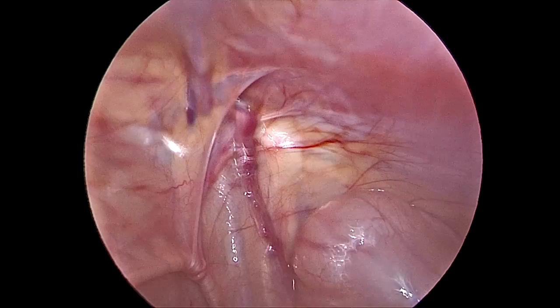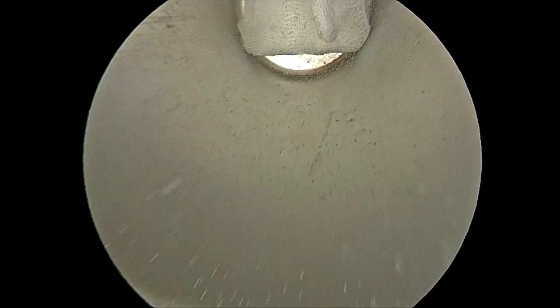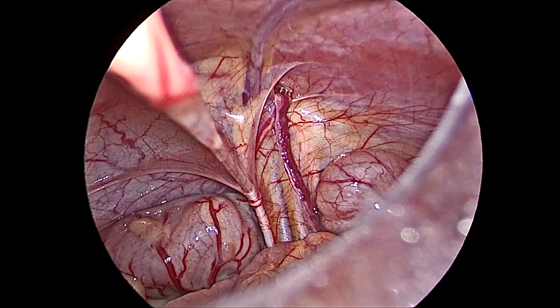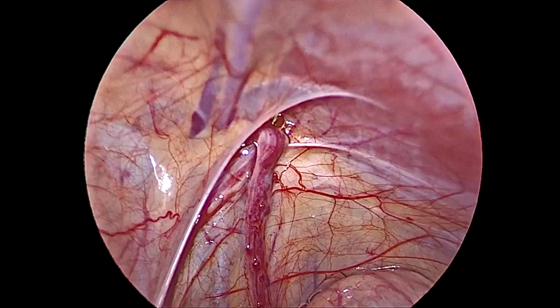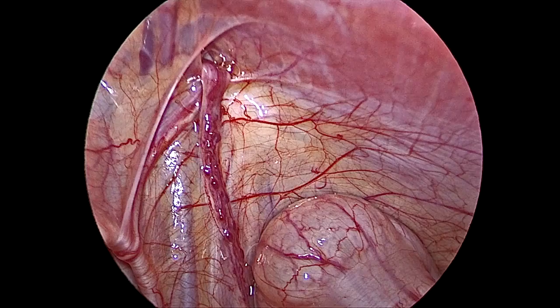We now see the testis in the inguinal canal. In the first five minutes, camera fogging problems will be there — we should use hot water liberally. You can see the gonadal vessels, the vas, the medial umbilical ligament, and the inferior epigastric vessels — all very clearly. Because fat is not present, you can see the external iliac vein, external iliac artery. The anatomy is as in classical description.